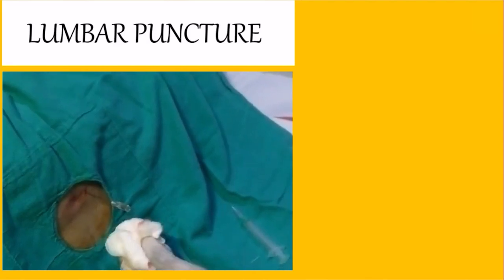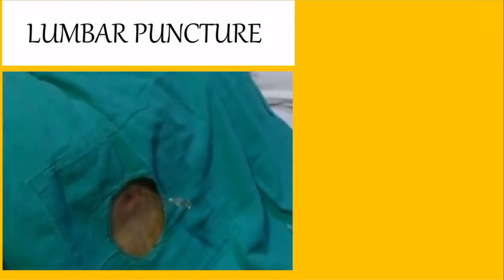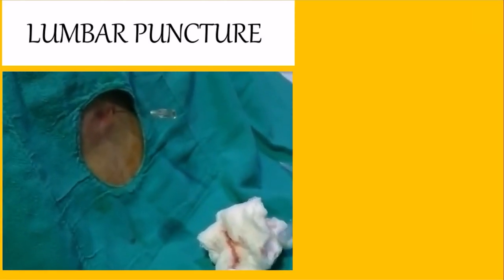Jai Hind guys, today we shall be talking about lumbar puncture, but before I describe the standard indications and the contraindications, it would be prudent to talk about the lumbar puncture needle per se.